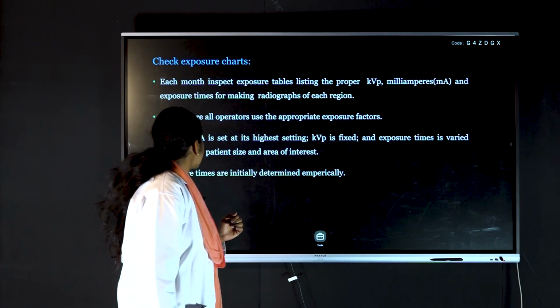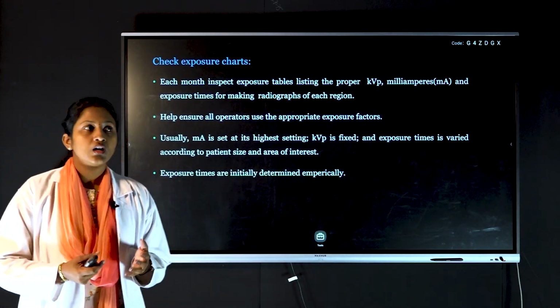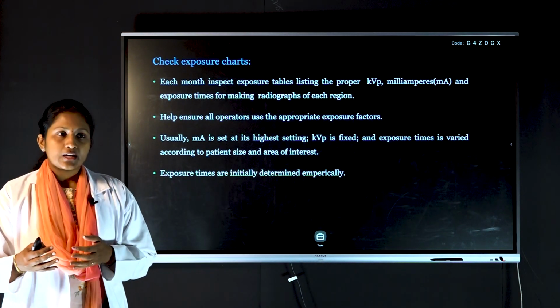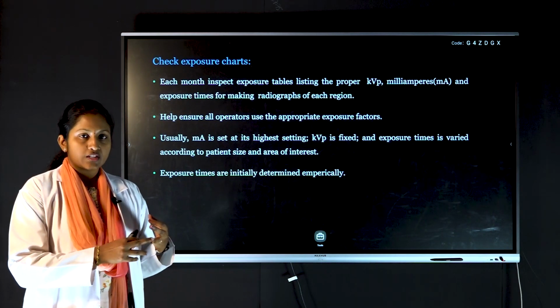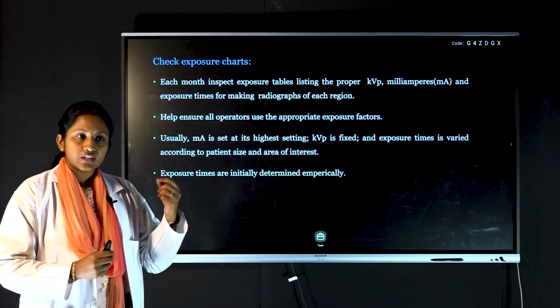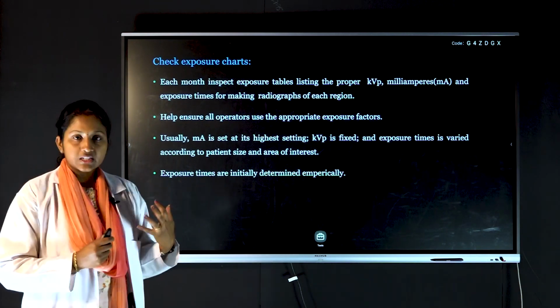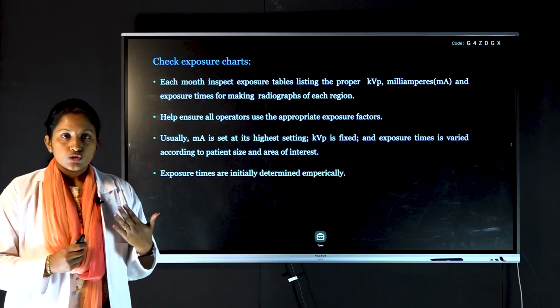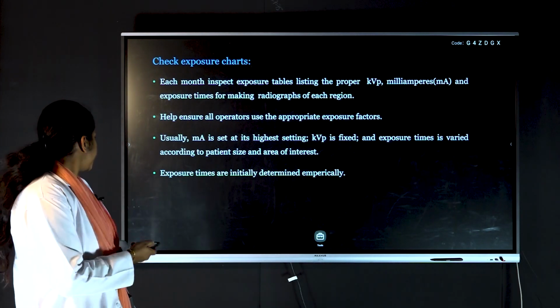Next, checking the exposure charts. So every day as we are taking the radiographs, we are using various parameters, the mA, kVp and exposure time. So all these should be entered and we should ensure that there is not much difference in these exposure parameters. For that, we have to check the exposure charts.